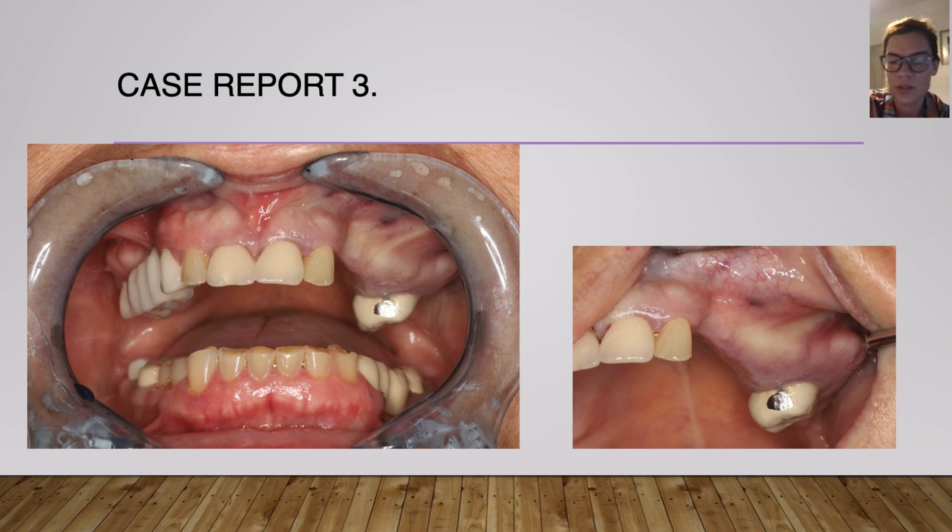But during these 2 years, the inflammation was so big, and there was a big fistula on the buccal side and pus formation and so on, that I was not able to make an alveolar socket preservation at the same time when I removed the canine. So I decided first to remove the canine, wait for this big inflammation to heal, and after make a horizontal ridge augmentation of the patient.